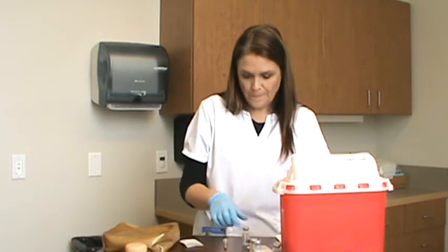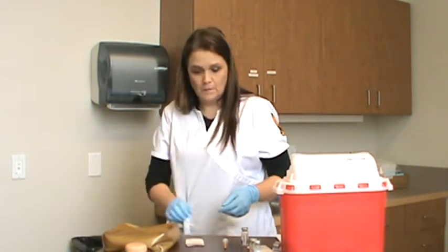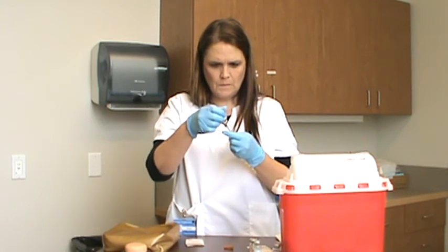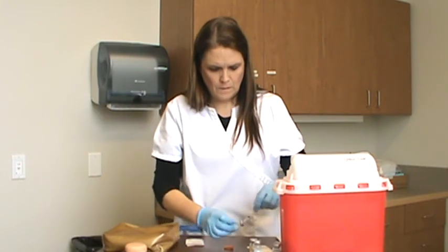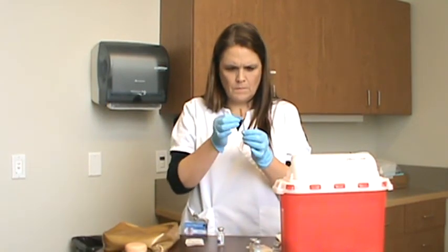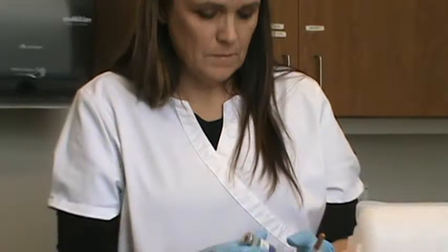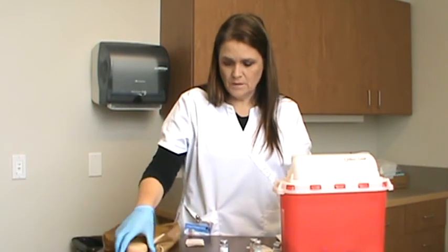I would draw up 0.1. Okay, I'm checking again to make sure. 11/24.